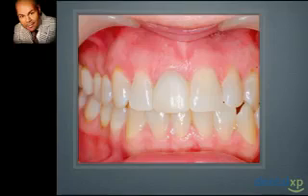He did this by utilizing partial thickness palatal grafts distal to the rugae with either a tissue punch or 15 blade. He preferred the blade and adapted them directly over the socket orifice, suturing to the margin, utilizing the blood supply from the site, instead of using a collagen plug or collagen barrier and a suture. I also would attempt to do this with success.